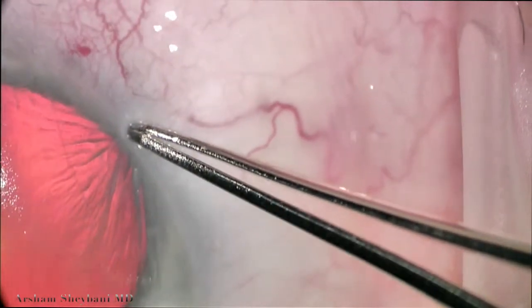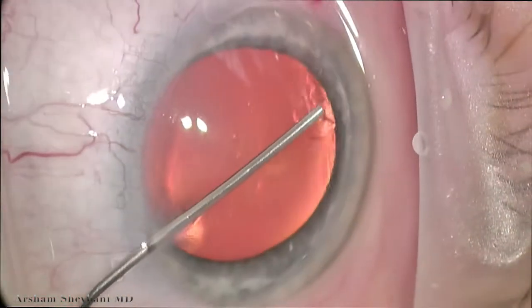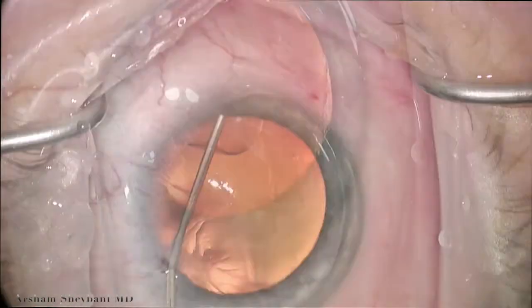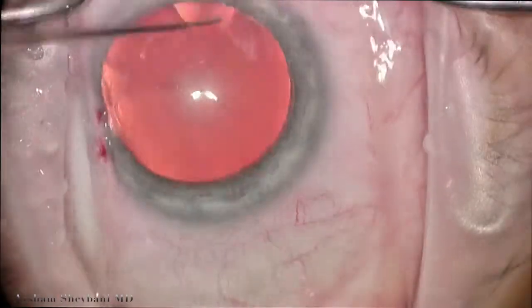So we mark it on the cornea with a pair of caliper forceps. Then once we fill the anterior chamber with a dispersive and then cohesive viscoelastic agent in the area that we're going to work, we make our temporal clear corneal incision and then place the viscoelastic on the cornea.